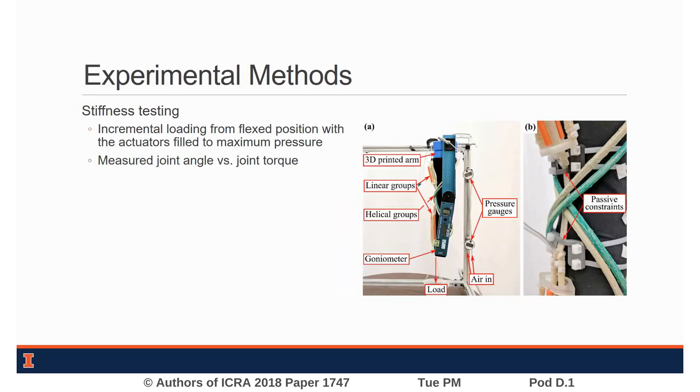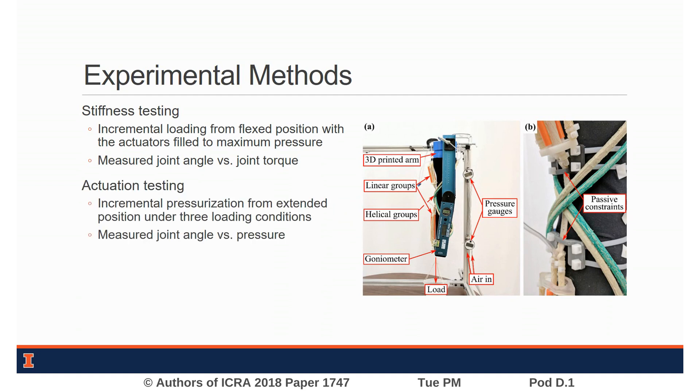We measured joint stiffness by pressurizing the FREEZ with the arm in the flexed position and applying incremental loads to the wrist, measuring joint angle at each interval. To measure joint actuation performance, we incrementally pressurized the FREEZ from the fully extended position and again measured the resultant joint angles.